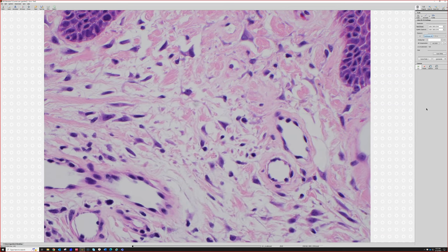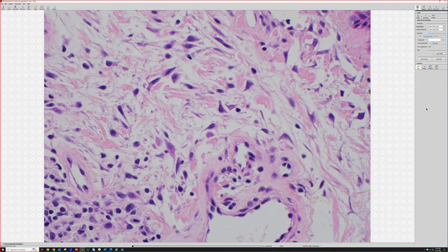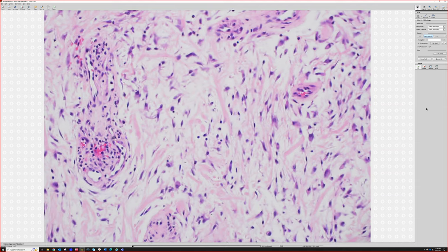If you're a Star Trek fan, you'll either love this or you'll hate it and say it's blasphemy and this does not look anything like this insignia. So the choice is yours. But in any case, when we say stellate, it means star-shaped, but what we really mean is triangle-shaped. I'm very literal, and I do not think these look like stars. Stars should be like 5 points, a little drawn out, or 6 points, but should be very symmetric, and that's not what this looks like to me. So I like pointy, spiky, triangle-shaped. Those are visual words that work for me. But you do you, whatever you like.